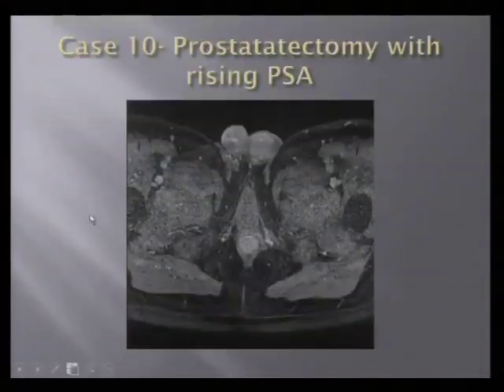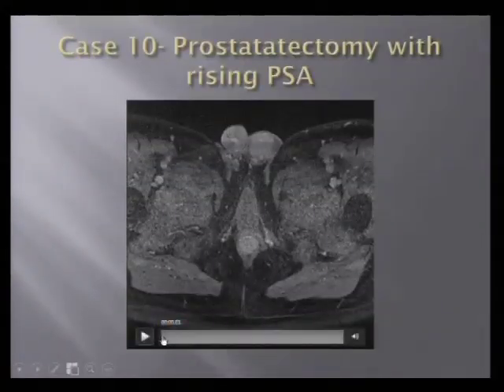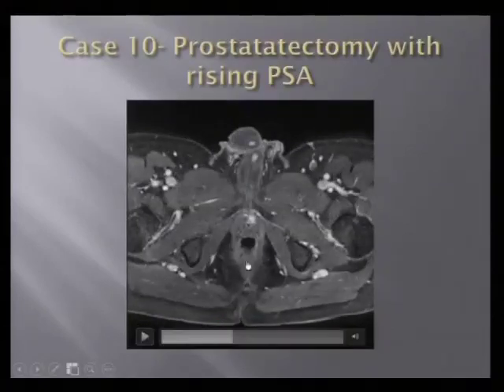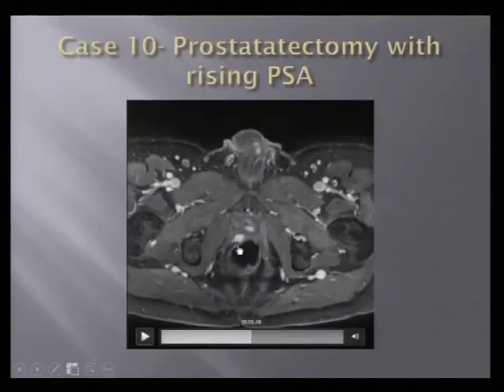And here's an example of a person with a prostatectomy with a rising PSA. And you can see right there, enhancement right there, and right there, significant amount of enhancement in the prostate bed.